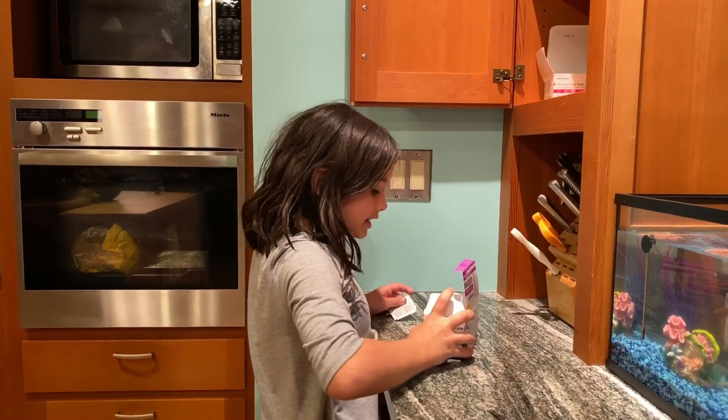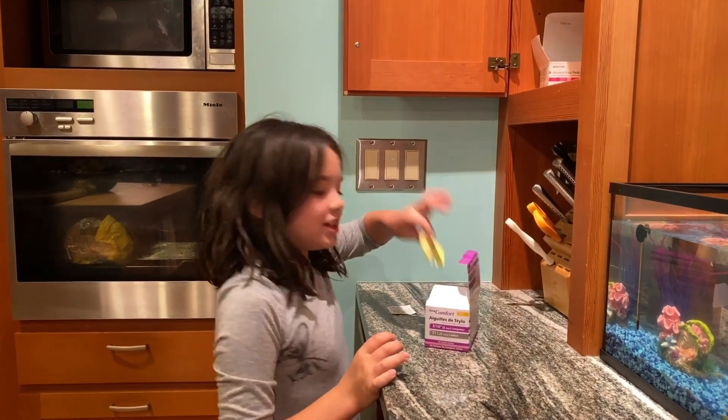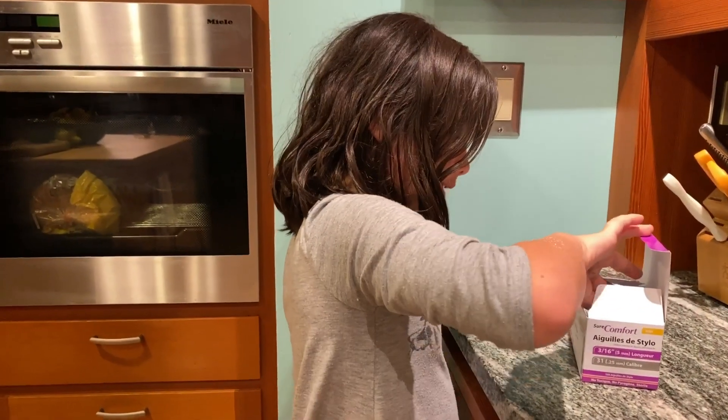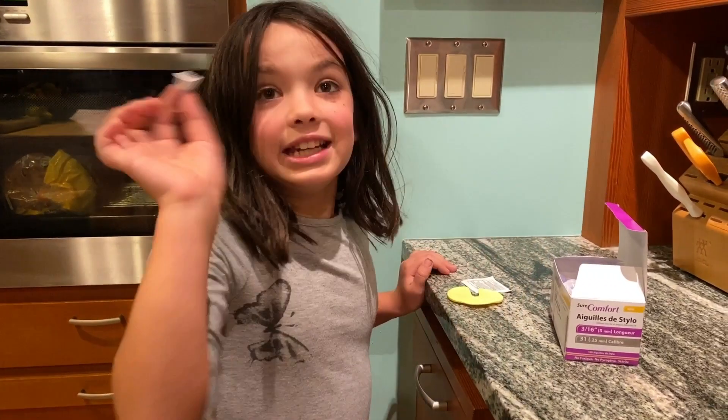Then next, if you have one of these awesome Buzzy Bees, you should use it. Or if not, you might even want to get one. And then I get the needles.